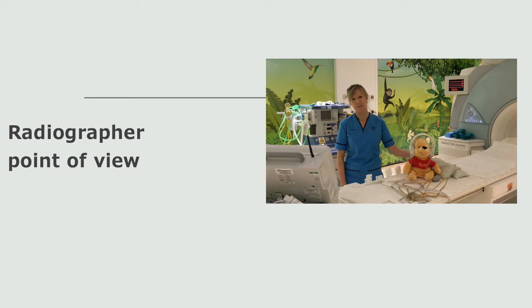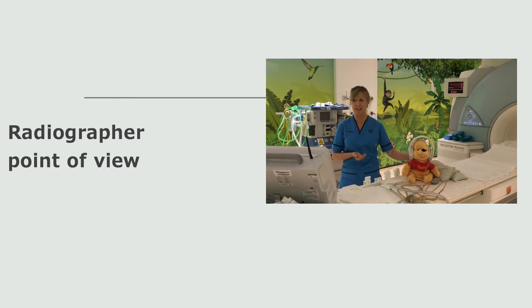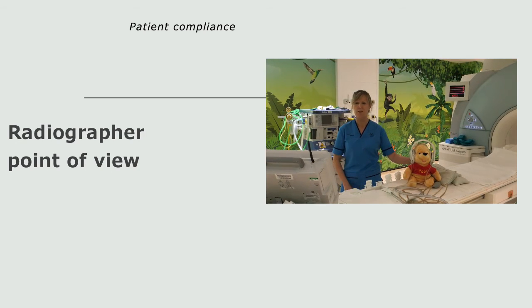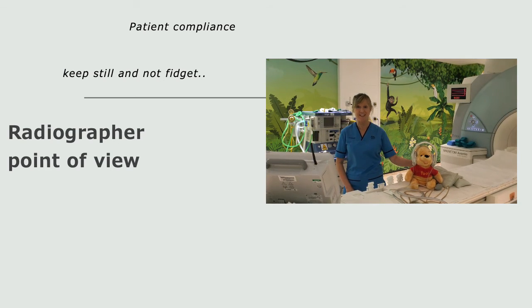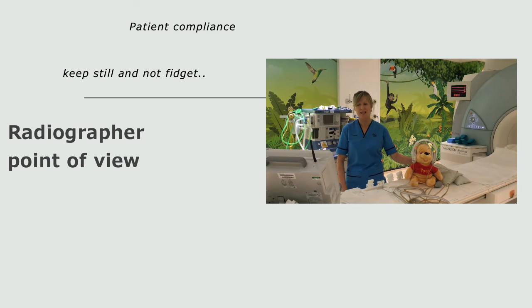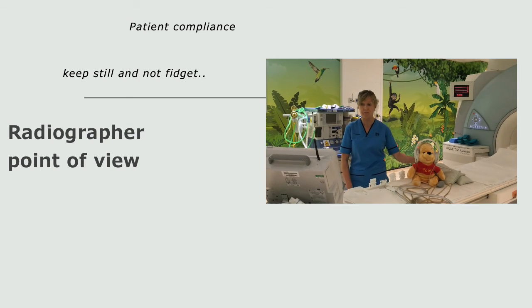In this next slide, my colleague Catherine Coyle is going to describe her experiences with scanning paediatric patients. So firstly, we need patient compliance, which can be tricky for some of our paediatric patients. We need the patient to keep still and not fidget. As cardiac MRI is not a quick scan, this can be particularly difficult for wee ones, especially after a long period of time lying in the same position.